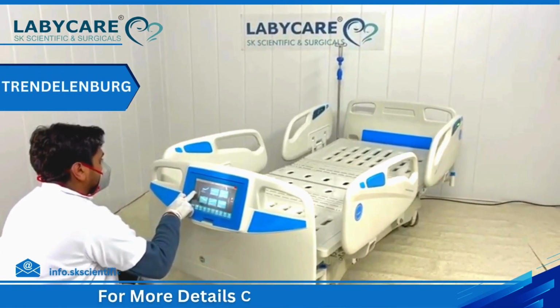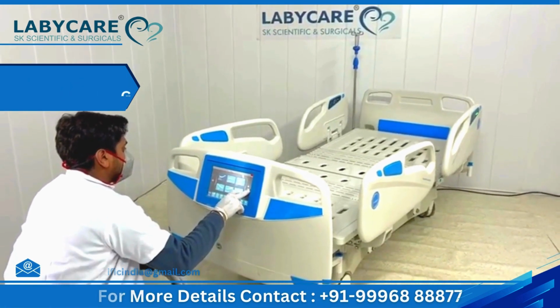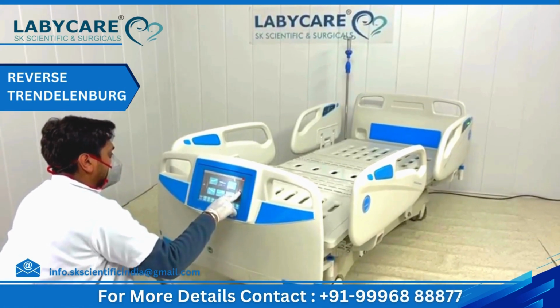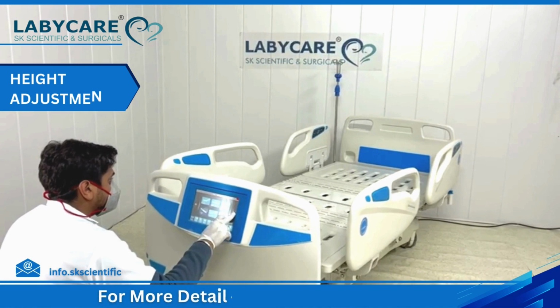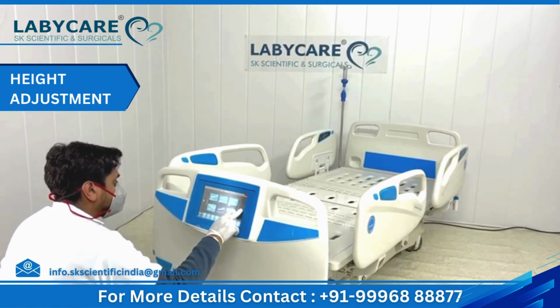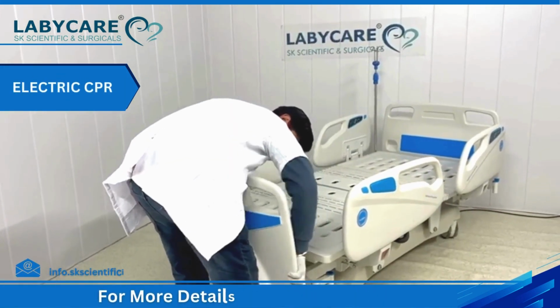Trendelenburg, reverse Trendelenburg position, height adjustment, electric CPR.